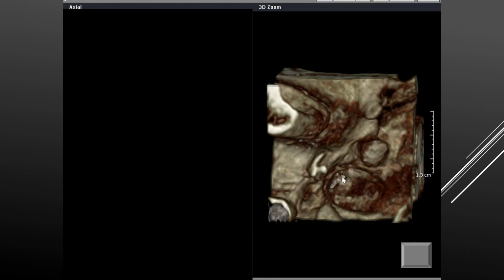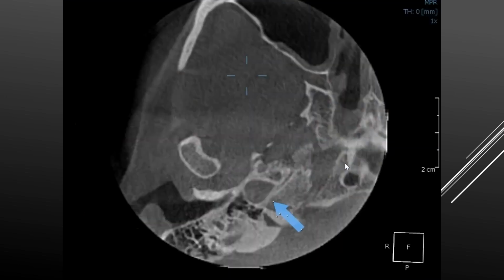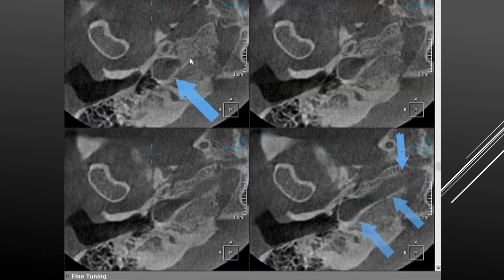All right. So small volume anatomy I'm not going to do. I will stop here and show you this one though, because this explains a lot. If you have a small field of view and you're looking at a condyle, this is the internal carotid artery. If we follow its path towards the sphenoid bone, you can see it's starting to open up here. It opens up more here, and you can see the entire length of the canal. Still seeing the condylar head.